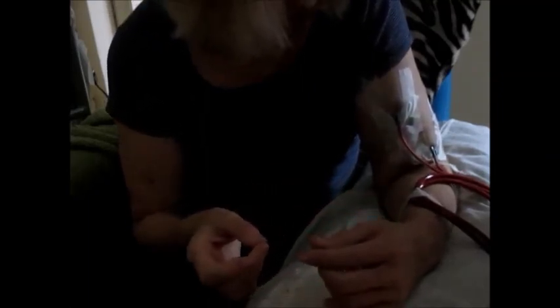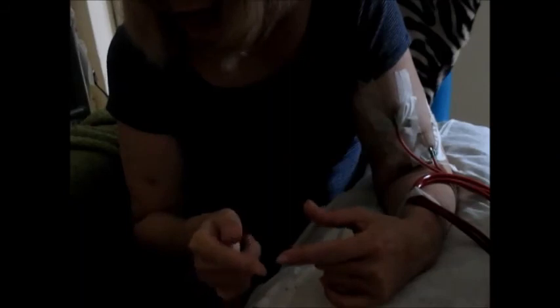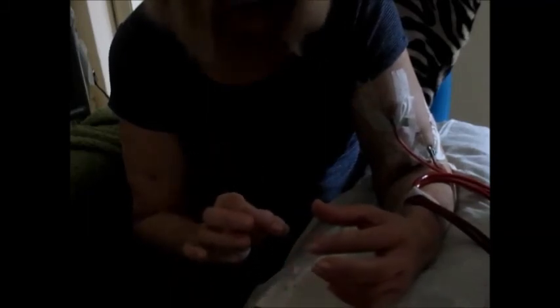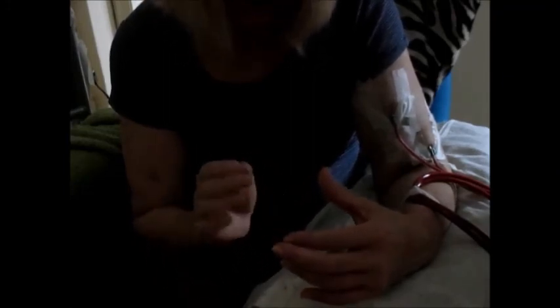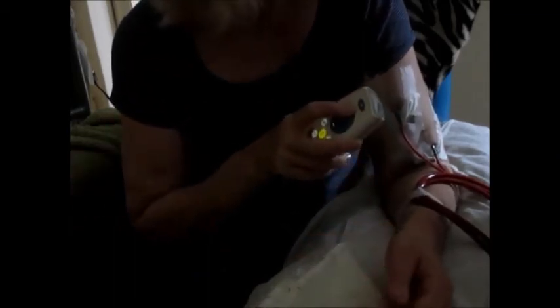I fold my pack over to use at the end of treatment. Some people may prefer to use a new pack at the end of treatment, but it's only my own microorganisms I'm exposed to. As long as you don't touch any of the key parts — which are the ends of connectors that are going to come into contact with your bodily fluids — you need to make sure you don't touch the ends of any connectors. That is known as ANTT — Aseptic Non-Touch Technique — which is one of the most important things.